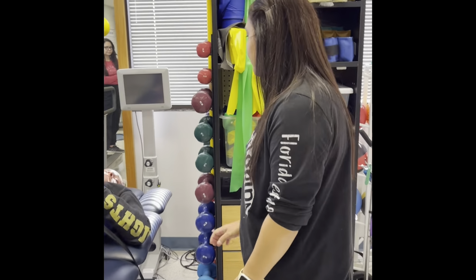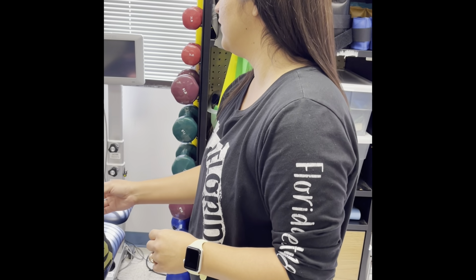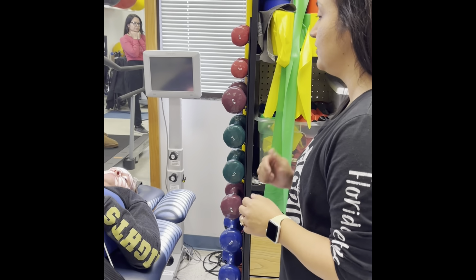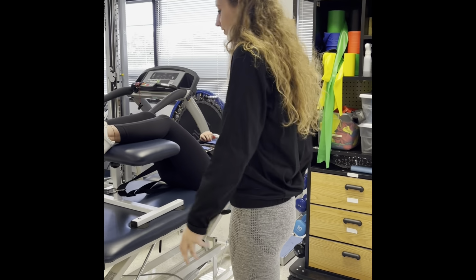Okay. All right. Before I walk away, are you okay? Yes. Hey, Becca, I'm going to give you this call switch. Make sure that if your pain worsens, or you feel no pain at all, you press that button, okay? Or you can just call me. All right? So now we're going to be starting the traction.